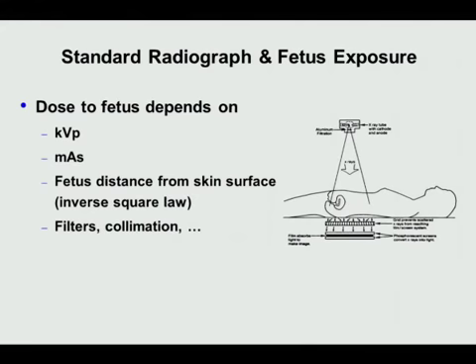The dose to the fetus depends on a number of factors, like most of you know. It depends on the tube voltage, the tube current, and the scan time, and also depends on the fetus distance from the skin surface. Again, the inverse square law works to the benefit of the fetal exposure. The other component which also has an impact is the filters, collimation, and so forth.